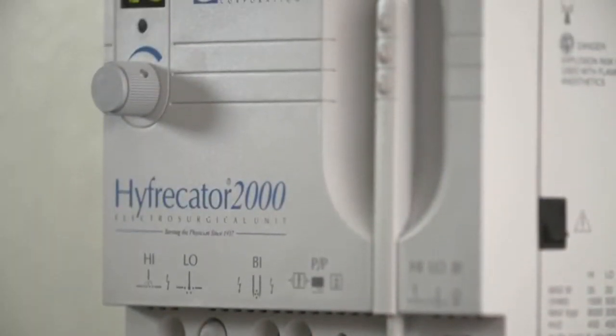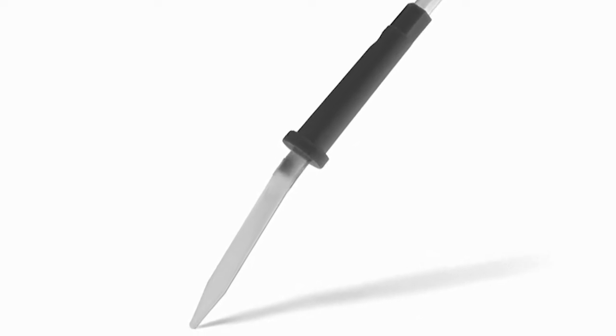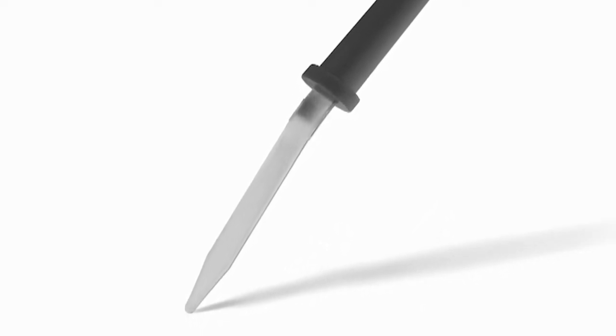Every electrosurgical procedure begins with the choice of the electrode and the power setting. The sharp-tipped electrodes are used for electrocoagulation and the treatment of fine vascular lesions. The blunt-tipped electrodes work well for electrodesiccation and curettage and the treatment of benign growths.